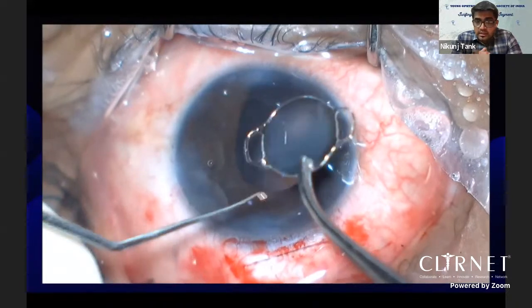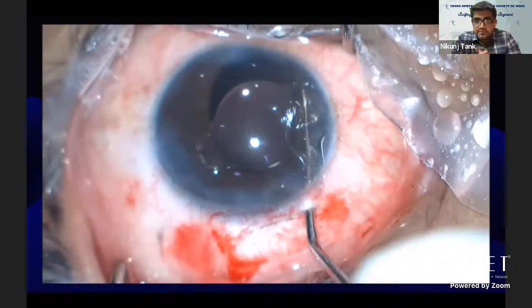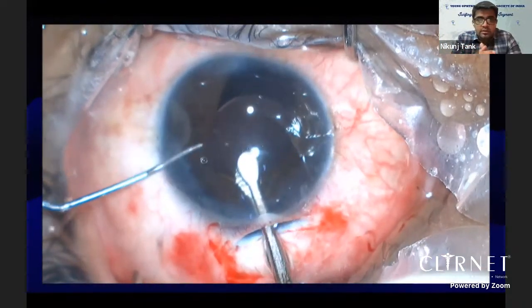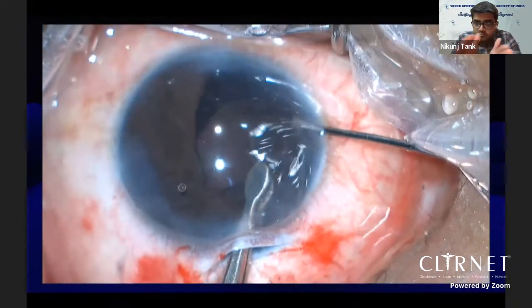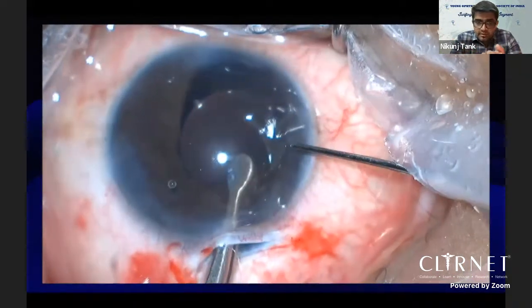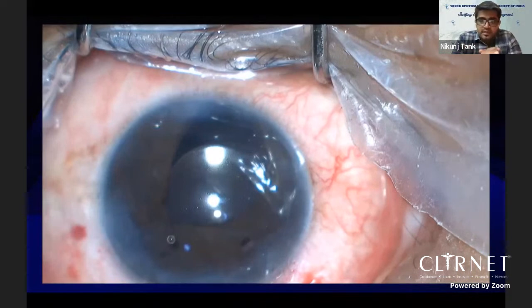First is the priming of the iris IOL: you should check that the claws are separating from each other. Sometimes there could be a manufacturing defect where the PMMA haptics are stuck to each other, so it should be checked beforehand. There is a specialized iris IOL holding forceps with a duck beak appearance, which helps us hold the IOL better than a McPherson's forceps. You can use that, following which a surgical PI was done using an anterior vitrectomy cutter.